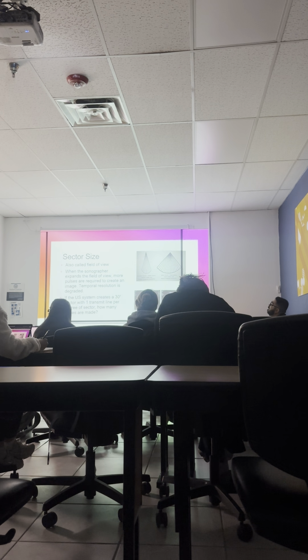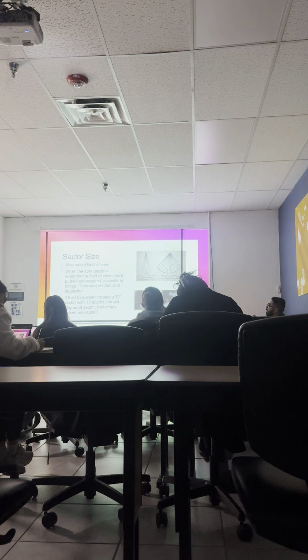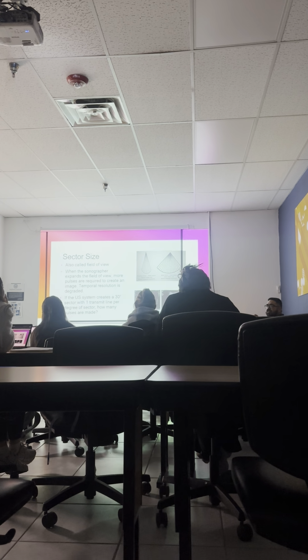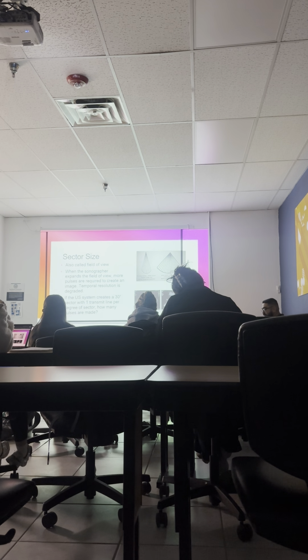Okay, so if the ultrasound system creates a 30-degree sector with one transmit line per degree of sector, how many pulses are made? 30. Okay, and if we reduce that sector size to 15 degrees, how many pulses will we have? 15. Okay, so that means that our temporal resolution increased, was improved. Yes?